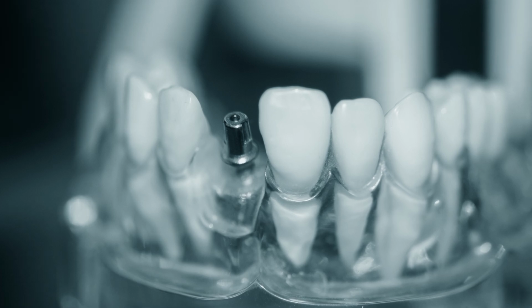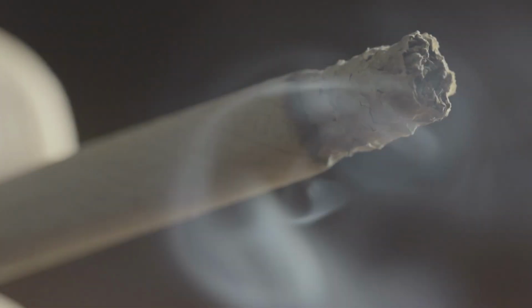In 3 to 5 months, the implant is totally, hopefully, integrated. There's like a 90% chance of success. And you have to pick and choose your patients, because sometimes people with diabetes that's out of control don't heal well. If a patient is a controlled diabetic, yes, you can do implants. Smokers, heavy smokers, it just makes things a lot harder. It can affect the healing process, and sometimes it just doesn't work with heavy smokers. But it's amazing that I'm like screwing in a tooth in somebody's head.